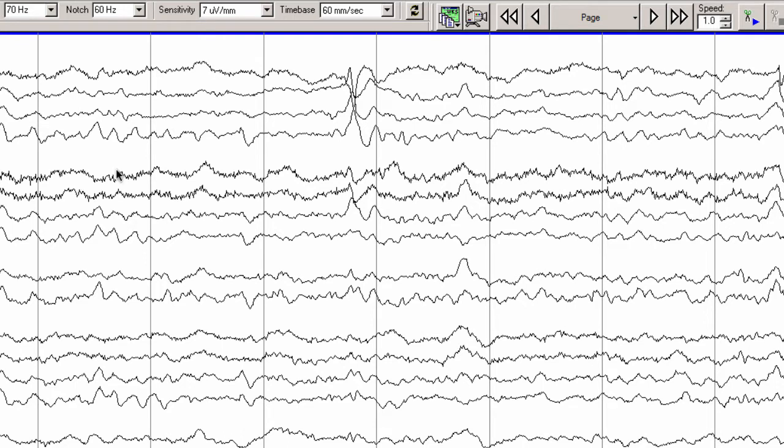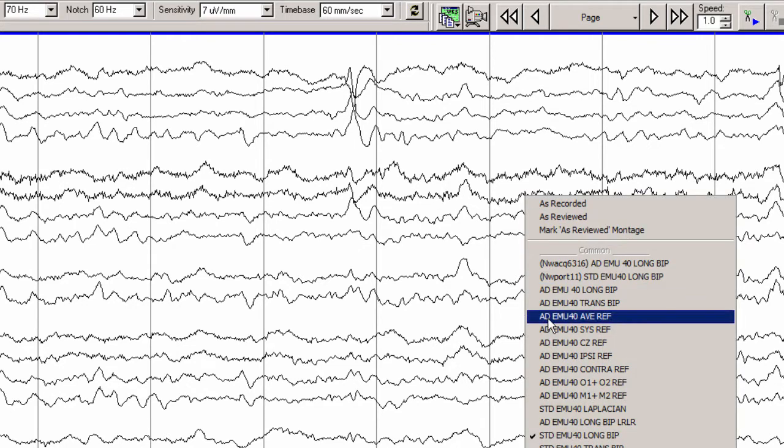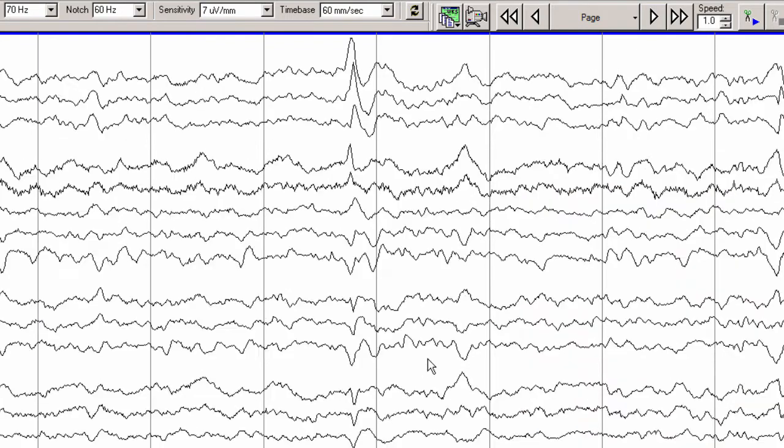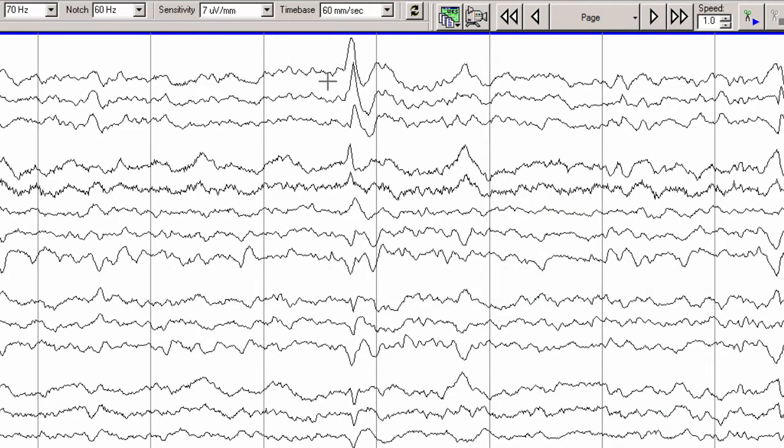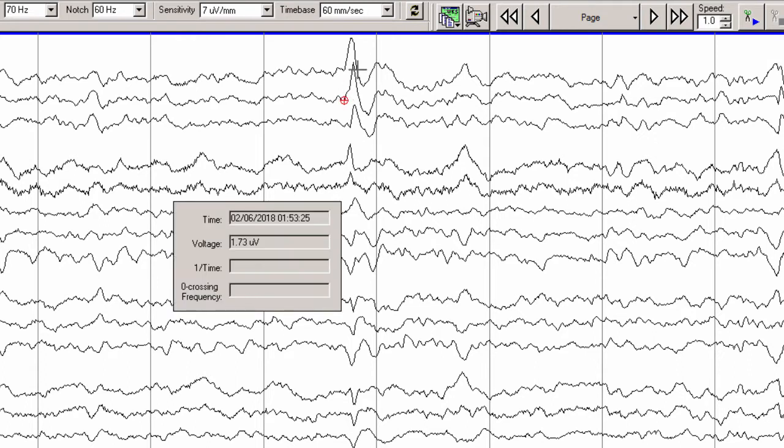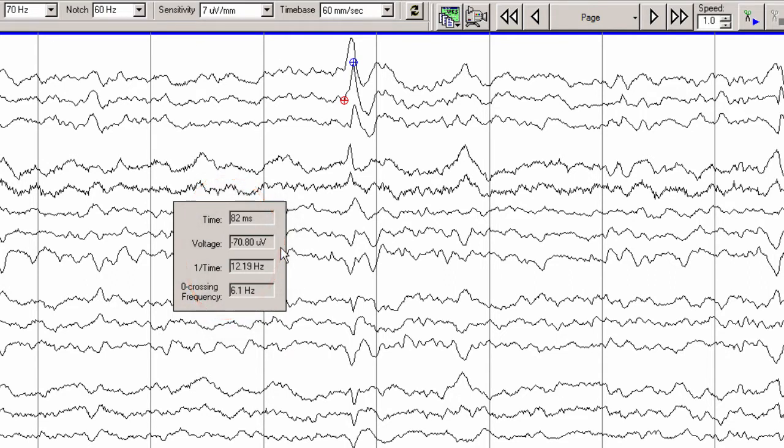You can see that this is much longer duration than our typical small sharp spike and much higher amplitude. This is probably best appreciated if we switch to a referential montage. In this case, the average reference montage. If we do a simple measurement on a referential montage, you can see that the amplitude of this is at least 70 microvolts and that's not counting the aftercoming slow wave.